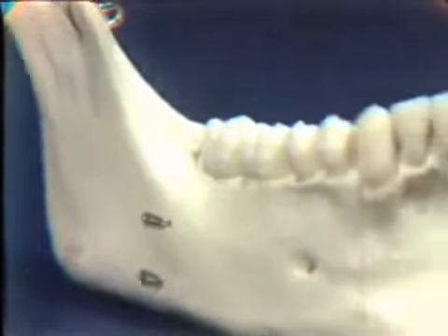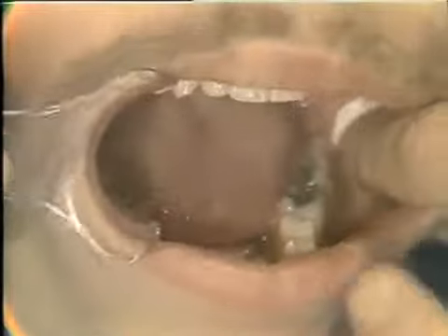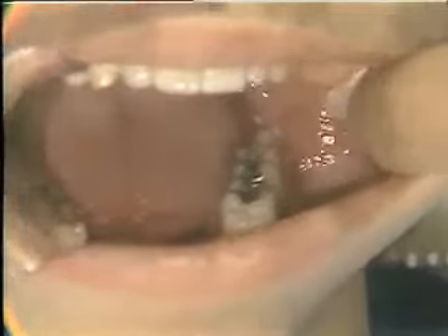All right, let's go to the patient. We ask our patient to open for us, and once again we're going to retract on the opposite side. Throws a little more light in here so you can see a little better. I'm drying the mucosa again with our gauze pad just as before, and then we retract his cheek, as you can see here, and this creates tension in these tissues in the vestibule in our injection site. And we'll paint a little tincture of betadine here on our injection site.